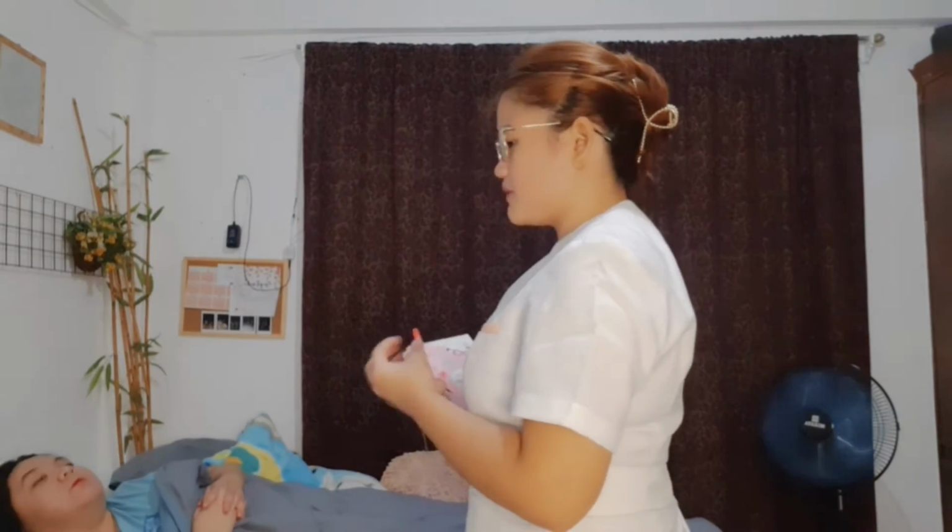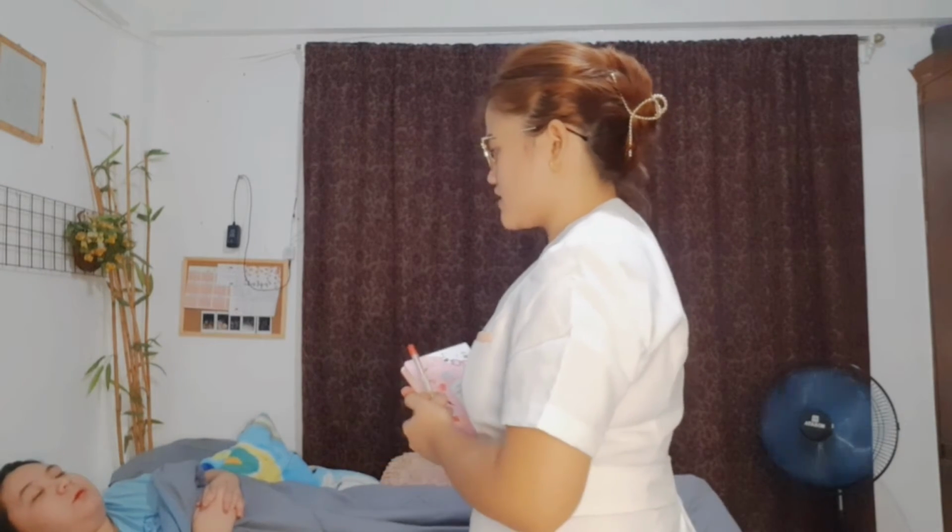Good afternoon. I'm Jamie Bervano and I will be performing the urinary catheterization. So I have here my patient. I will ask her name and initial information about her, and if she has an allergy to povidone iodine and also latex. So ma'am, good afternoon. I'm your nurse for today. I will be performing the urinary catheterization.